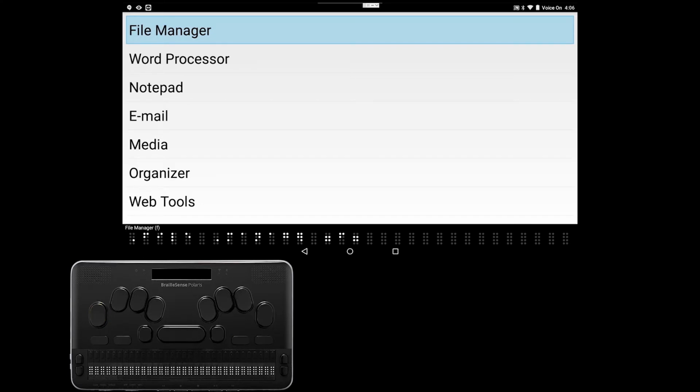Now, I'm going to cover other ways to change these same settings. Let's start with Braille code. An alternative to changing the Braille code through the global options is to use a hotkey. The hotkey only allows you to cycle through the different options, so if you go past the option you wanted, you'll have to go through all the options to get back to your preferred setting. That's why I prefer the global options approach for settings with a long list of options.